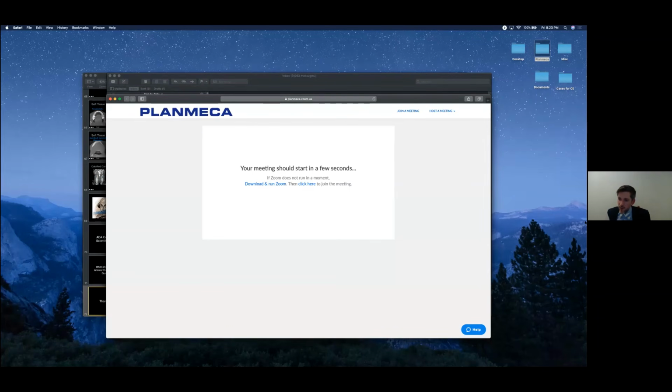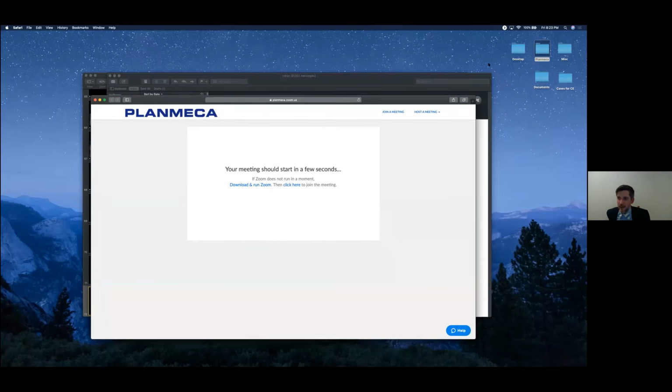Someone asked, what is the equivalent radiation dose for ultra low dose for a 17 by 20 scan? If Planmeca will be doing a specific one relating to ultra low dose, I can look at it then.